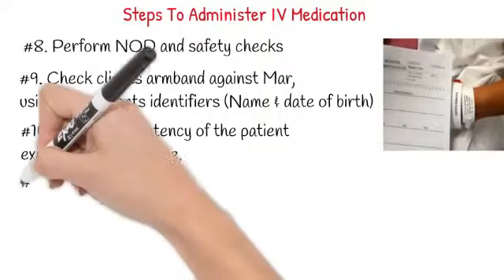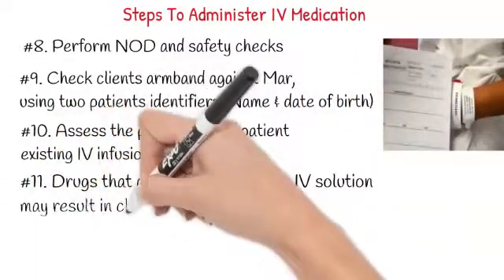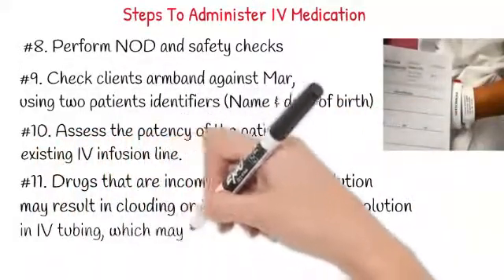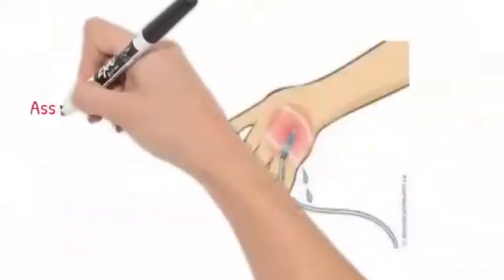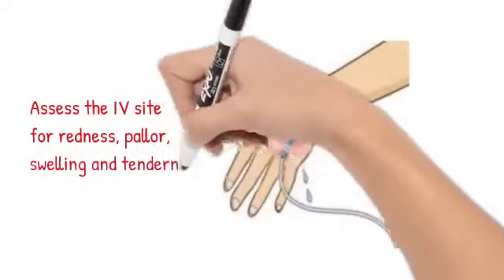Drugs that are incompatible with the IV solution may result in clouding or crystallization of the solution in the IV tubing, which may be harmful to the patient. Assess the IV site for redness, pallor, swelling, and tenderness.